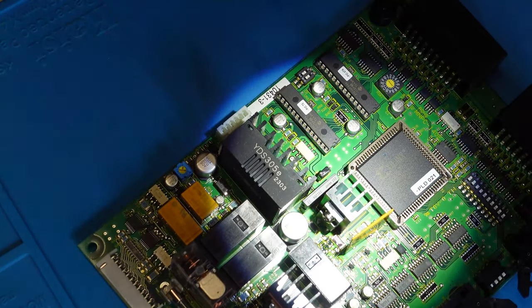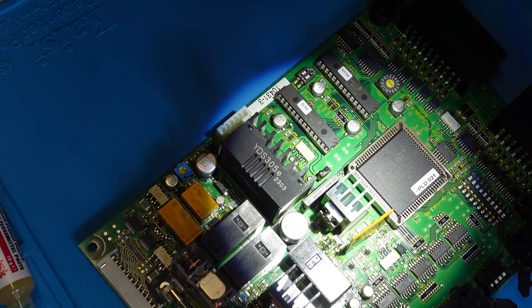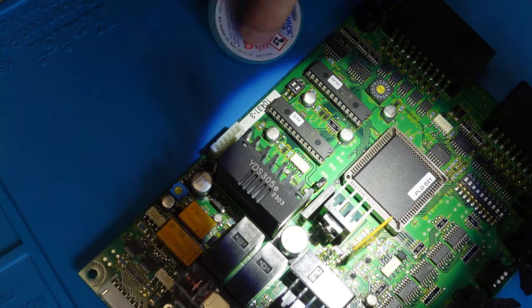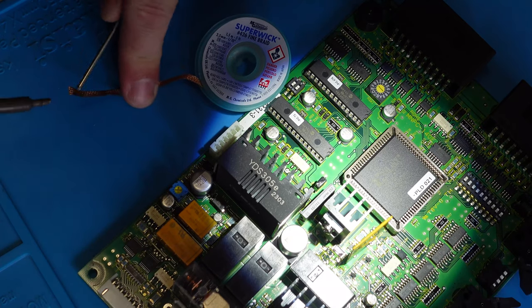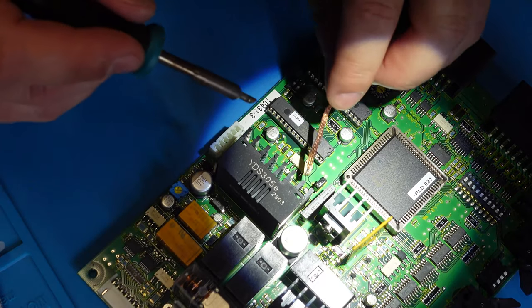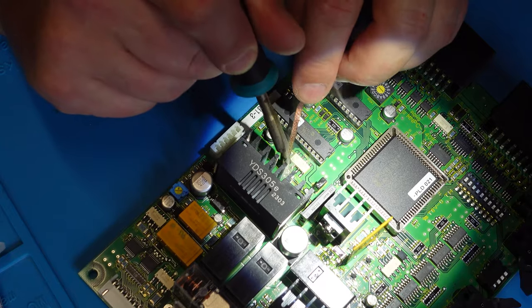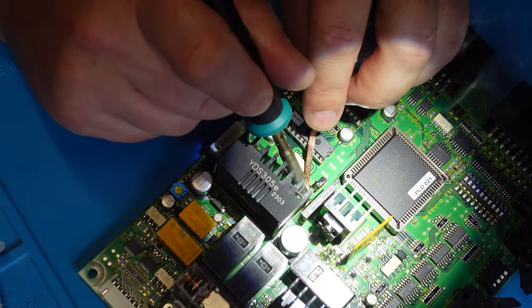Okay. And here is where we use the soldering iron to clean up the old spots with some solder wick. So one of the first things I'm going to do is put some paste flux on the solder wick. There we go. And I'm going to apply that down to the old holes, and there we go. Suck up some of that extra solder that used to be there from the old fuse.